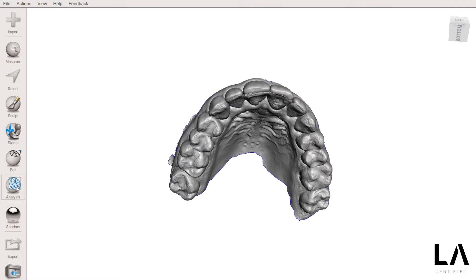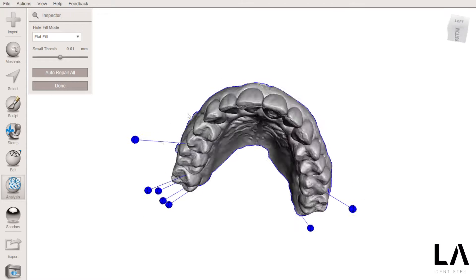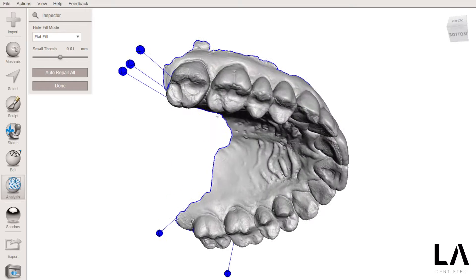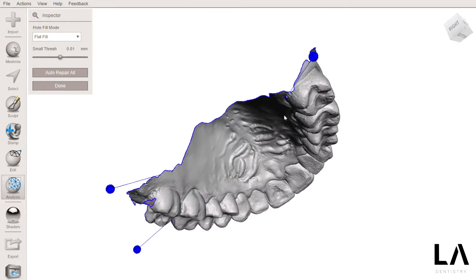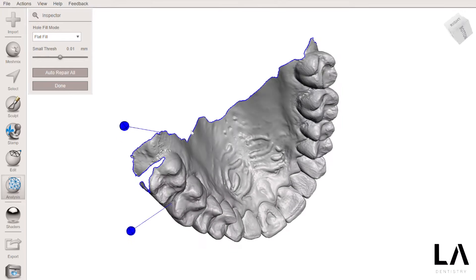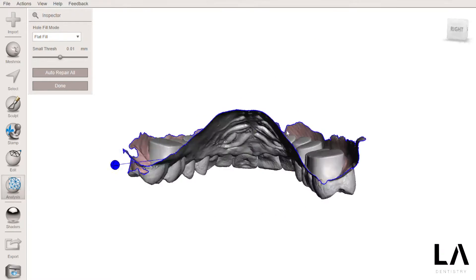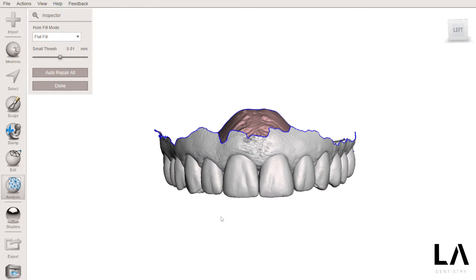The first thing I need to do is go to Analysis and Inspector to see if there are any problems with the meshes. We can repair them one by one, but I prefer to see how the software is dealing with the mesh problems. The issue here is that the mesh is open, but I don't want to close it.